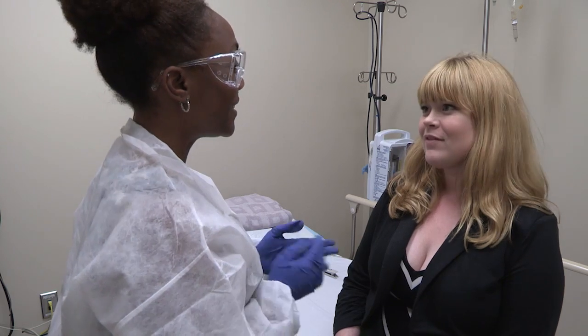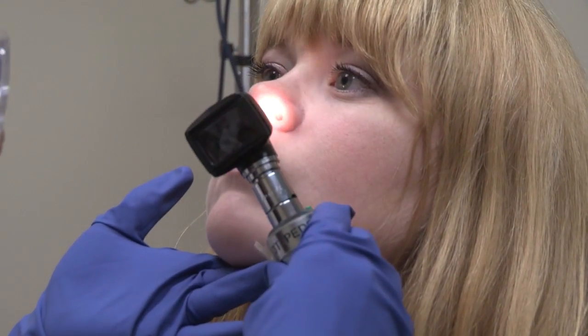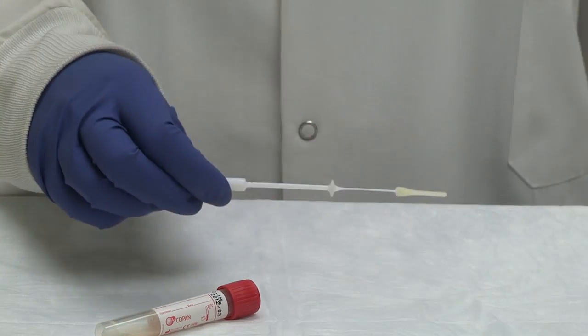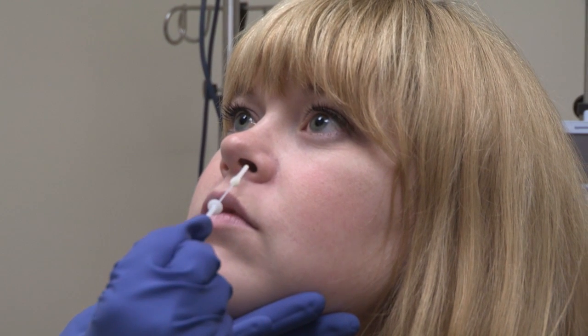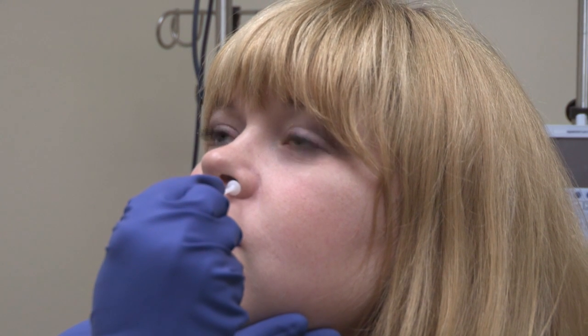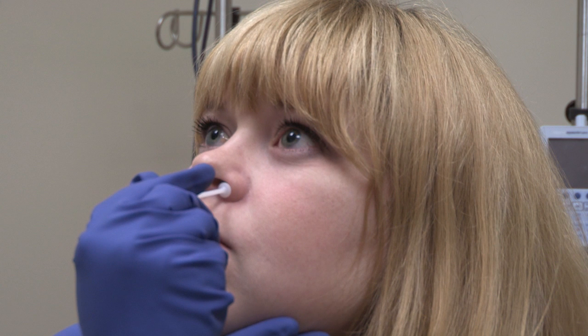Explain to the patient what you are about to do. Check for nasal obstructions that may interfere with sampling at the correct site in the nose. Open the swab package and remove the swab. For this mid-turbinate sample, gently insert the swab into the nostril inside the nares and use a gentle rotation to firmly sample the membranes of the nasal wall.